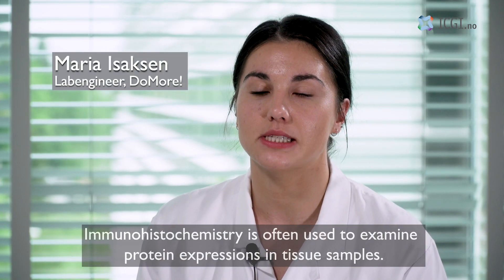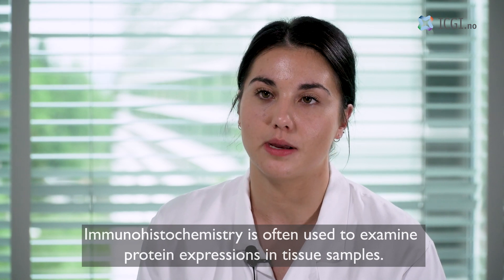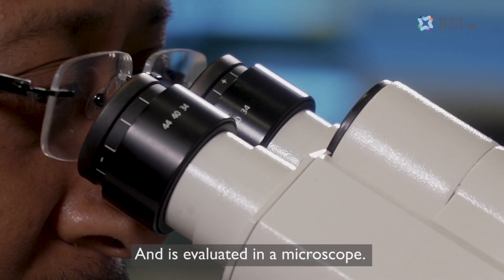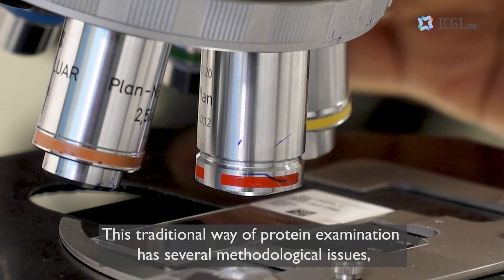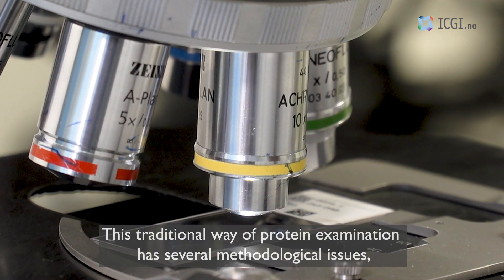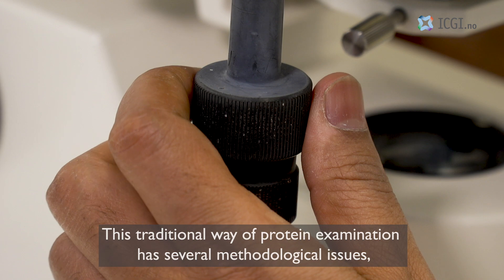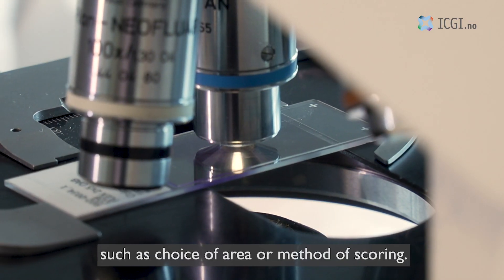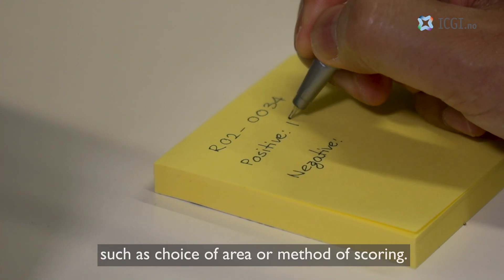Immunohistochemistry is often used to examine protein expression in tissue samples and is evaluated in a microscope. This traditional way of protein examination has several methodological issues such as choice of area or method of scoring.